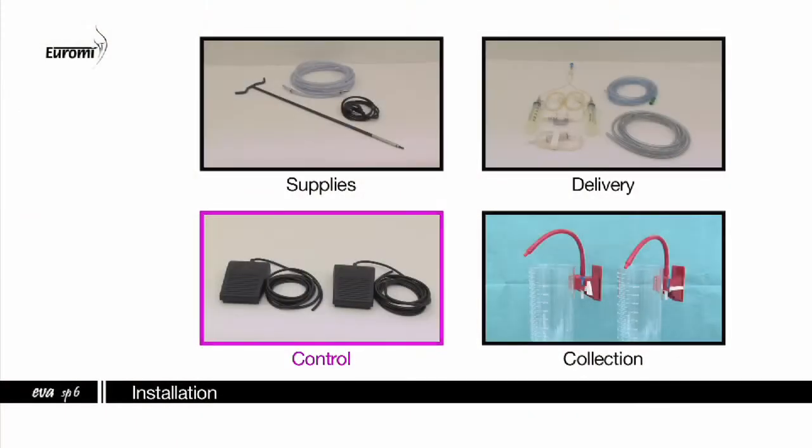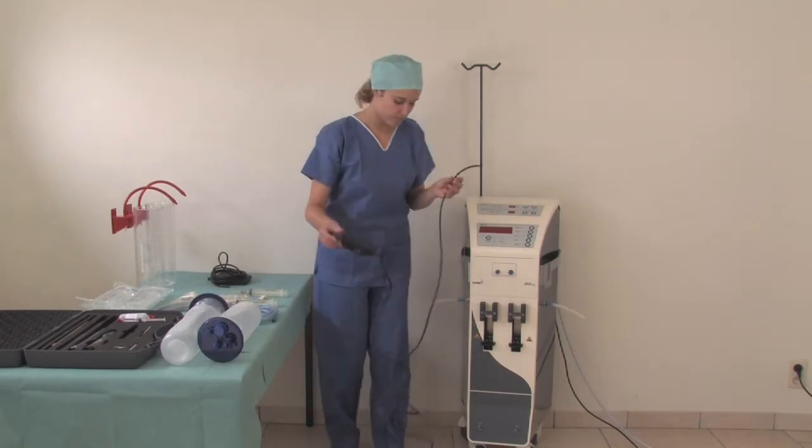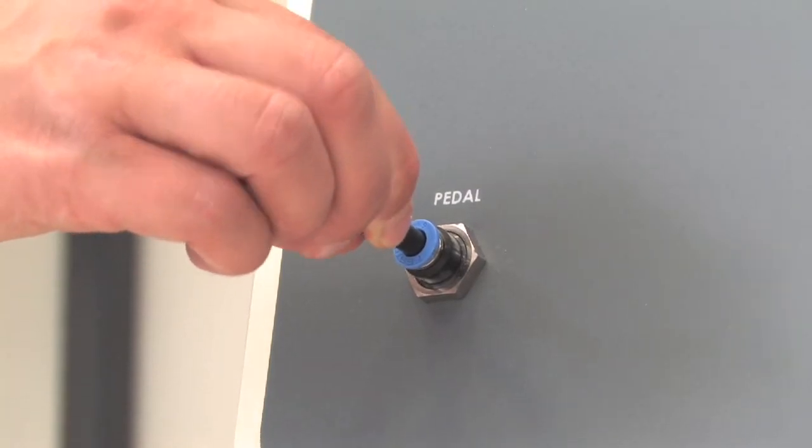Control accessories assembling. Connect both pedals to the machine. They have the same function and can be placed at a location of your convenience.